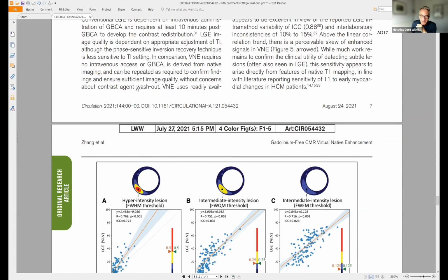Before I take those, just from my own curiosity, so you also included the cine images or the information from the tissue of the cine images, right? Which is technically a T2 over T1, or do you mainly use it for the contouring or for defining the anatomy? So we input the networks the stack of cine frames. So this gives not only the contrast information, but also the wall motion information from cine.